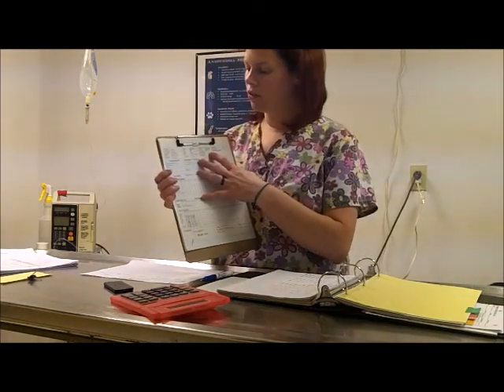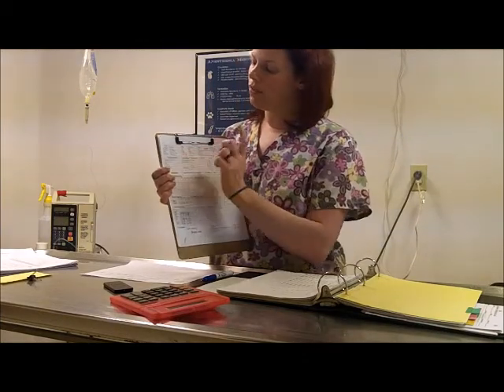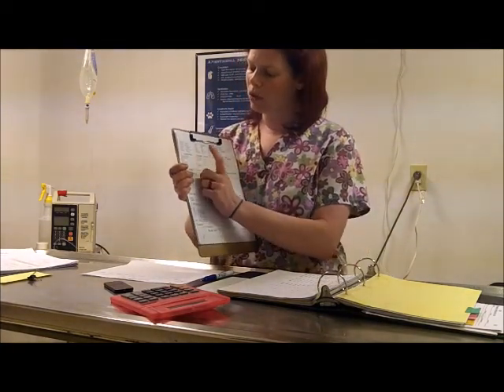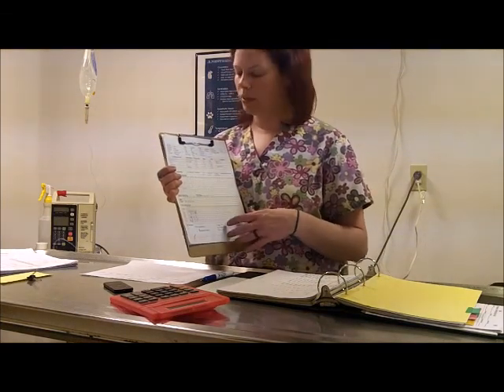So most anesthetic monitoring forms each vary slightly, but the first part is the information and signalment of the pet and the owner and the performing doctor. So again, we'll have the name of the pet, the owner's last name, any identification required for the clinic, such as an account number, the breed of the animal, and the procedure that's being performed, today's date, the continued part of the signalment, the sex, age, and weight of the patient. Our weight here is written in pounds and kilograms.